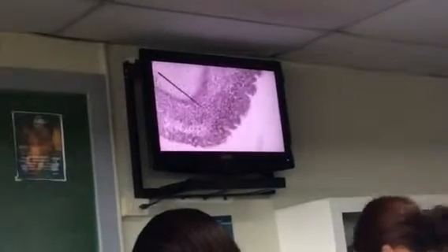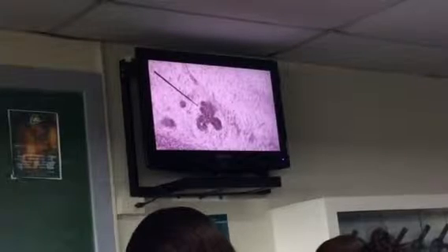You may identify as well some glands. Specifically what you call your Bowman's gland. Ano tayo? Yan. Bowman's gland. Nakakita ako isang grupo dito. Pagkalaki. Yan.